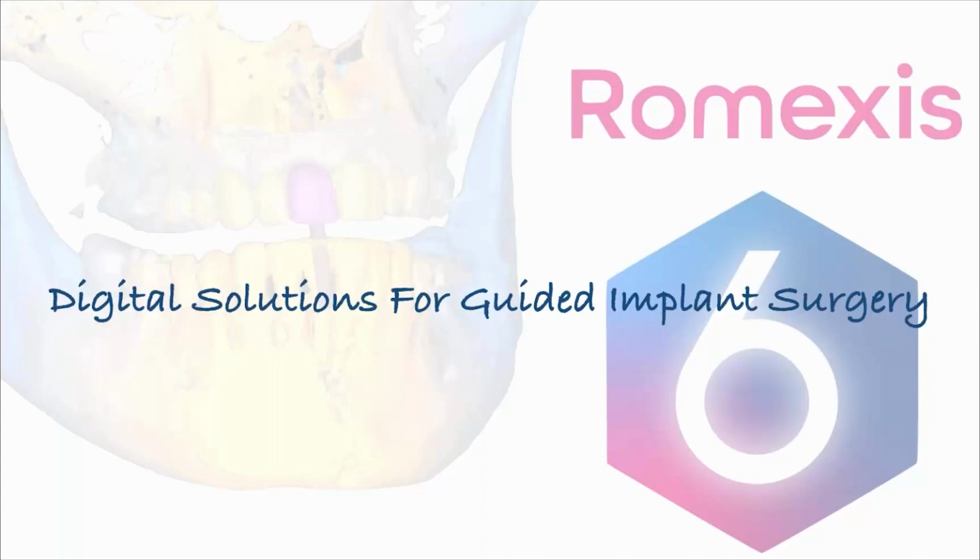And the focal point for that is definitely the software that allows this to happen. And again, we're really fortunate to have had the ability to use Romexis. We have a lot, if not all, of the major software systems available to us at MUSC for guided implant planning. And a lot of them have their strengths and weaknesses.